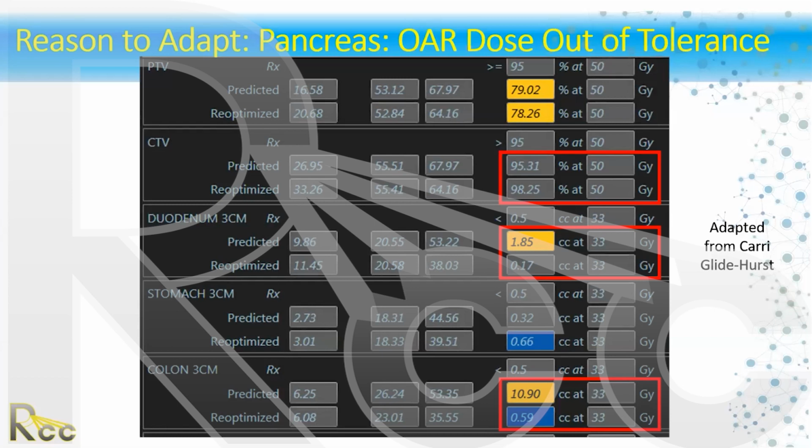And we found the same result. So even though the patient's on the treatment table for an hour, the main issue becomes, can the patient tolerate being there an hour? But in terms of dosimetry, it doesn't really make much difference. Okay, great. Thank you. Sure.